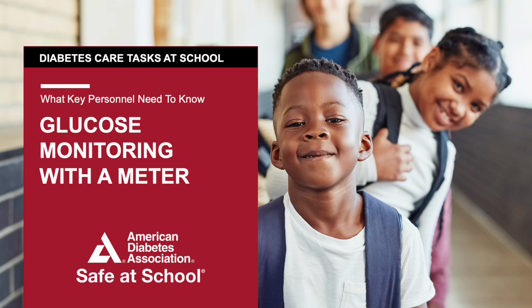Glucose monitoring with the meter. The school nurse, when available, is the most appropriate person in the school setting to provide care for a student with diabetes. However, many schools do not have full-time nurses.